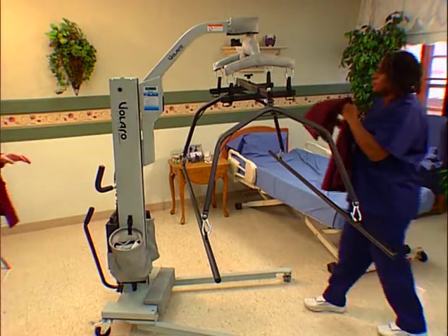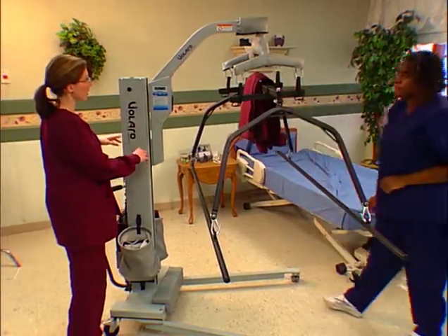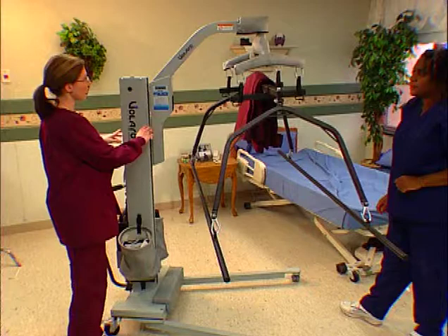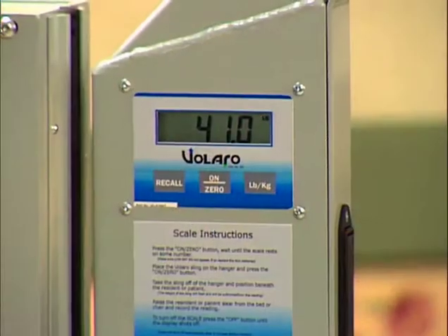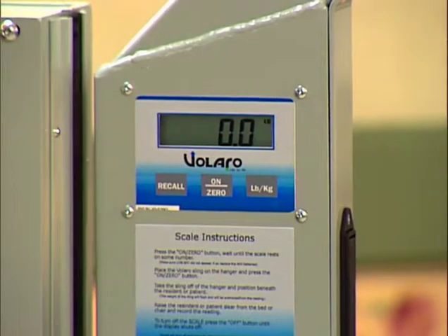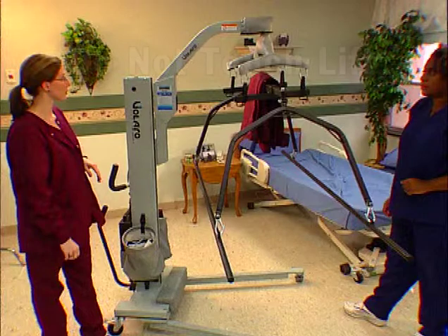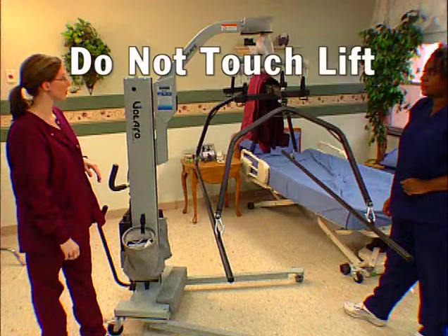Suspend the sling and accessories from the hanger bar with the four hooks, making sure they do not come in contact with any other part of the lift or the floor. With the scale on, press and release the On Zero button again. In a few seconds, 0.0 will appear on the display. It is important that you do not touch the lift during this countdown.